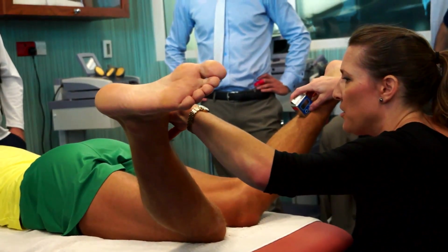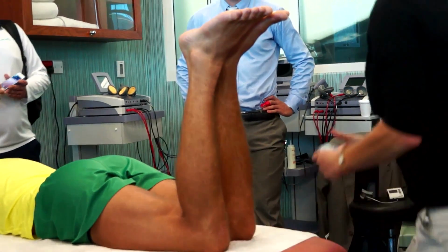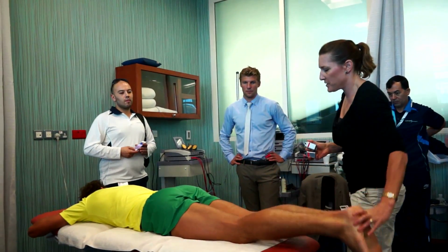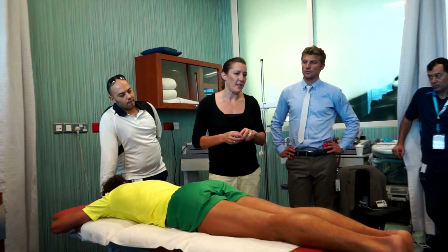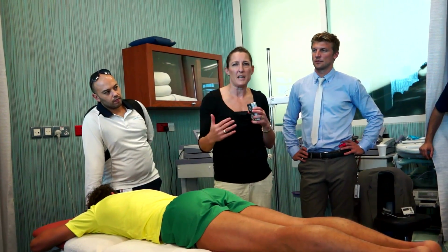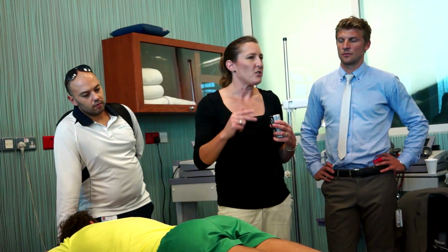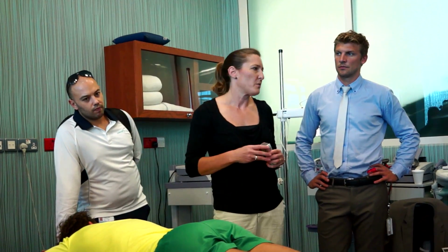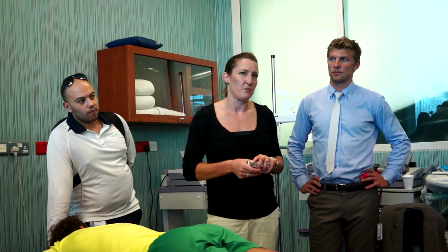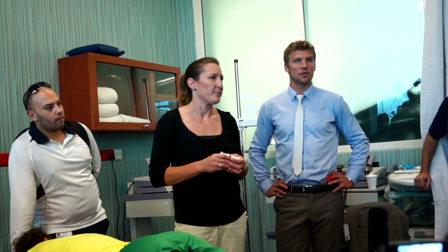Okay, and then you just press hold, and you automatically get 2 measures, and then reset after each test. In our reliability trial, we looked at measures of the range of motion with 3 repeated measures. And what we found was that it didn't add any value to the reliability if you did the 3rd measure. It made a difference whether you did 2 versus 1 measure, but not a greater reliability if you took the average of 3 measures. So we recommend using 2 measures for the range of motion measures. For the range of motion, taking the average and not the highest or lowest. So the average of the total.